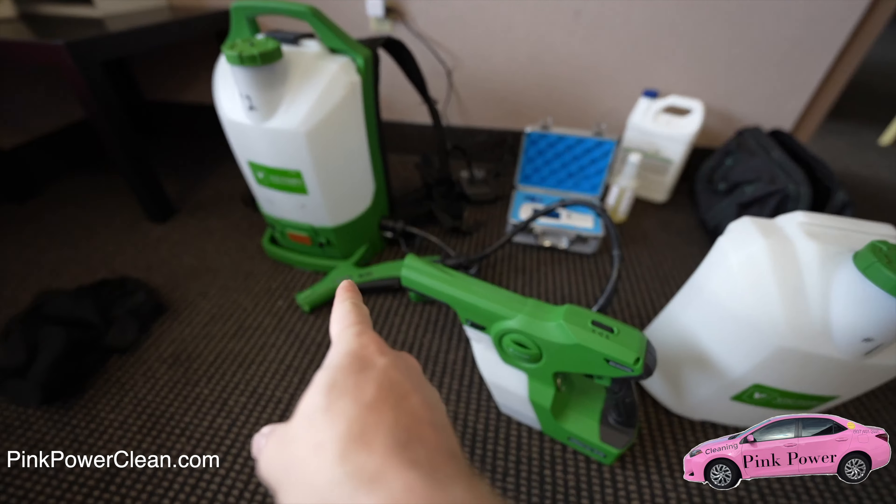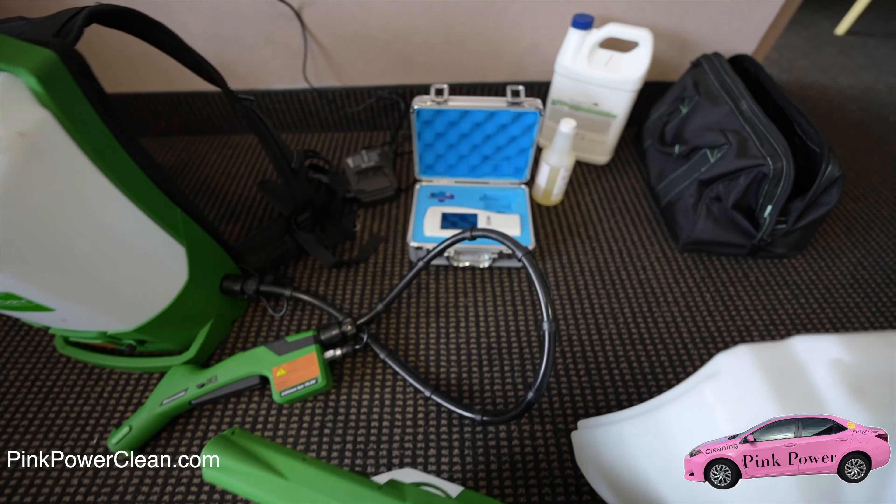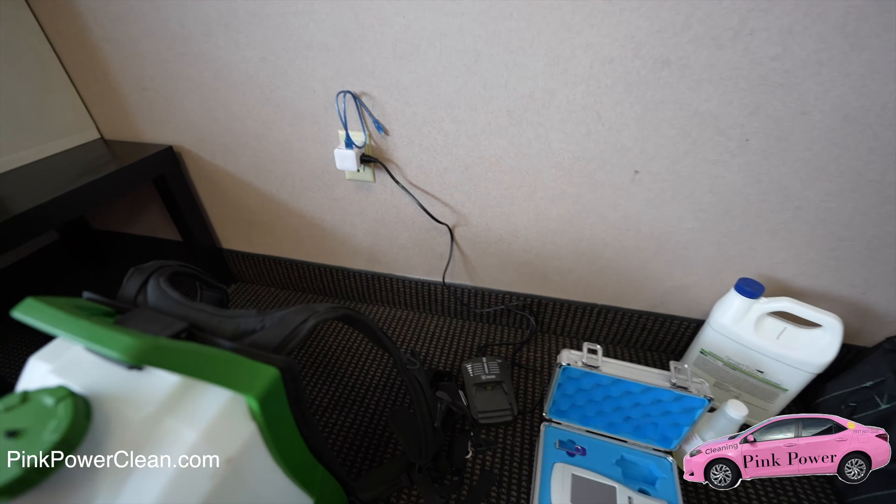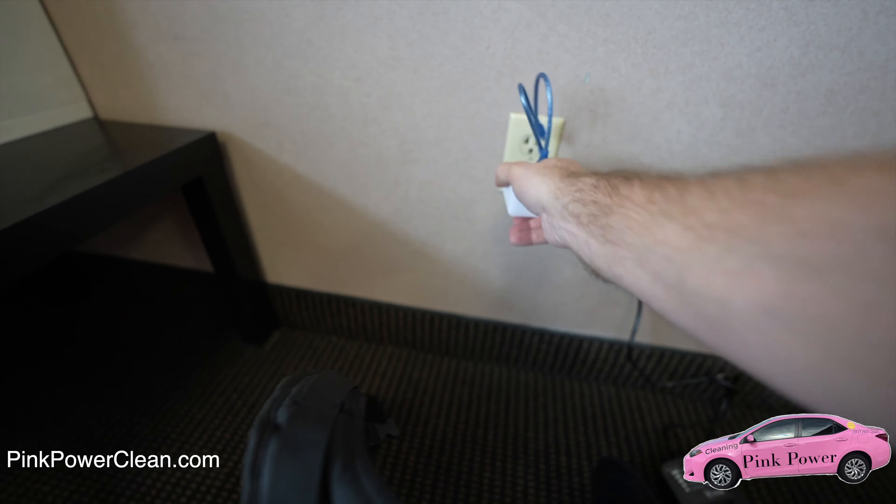We did step number one, step number two, and the ATP testing. So now what we're going to do is actually put everything away. We'll unplug first the ATP.